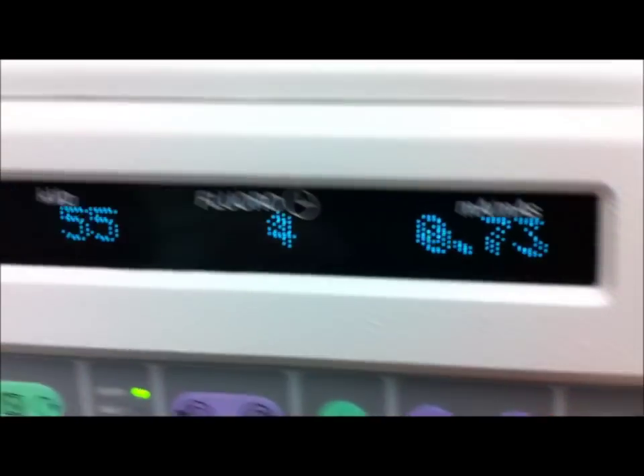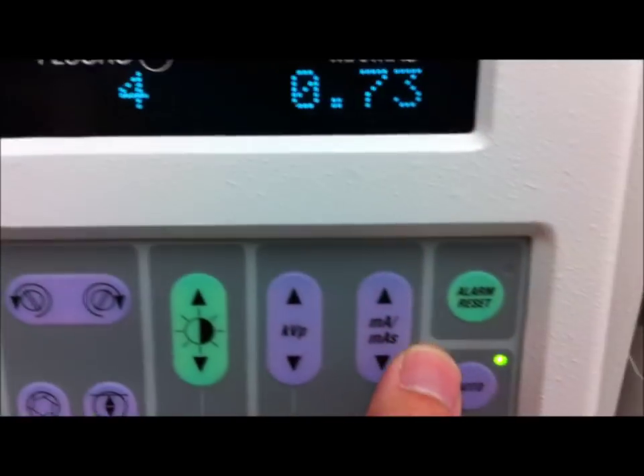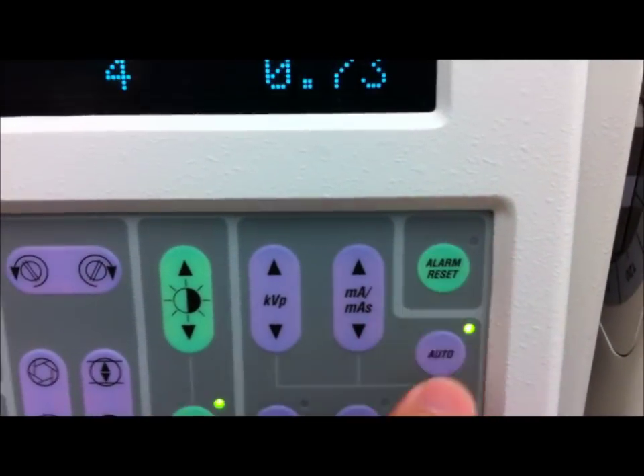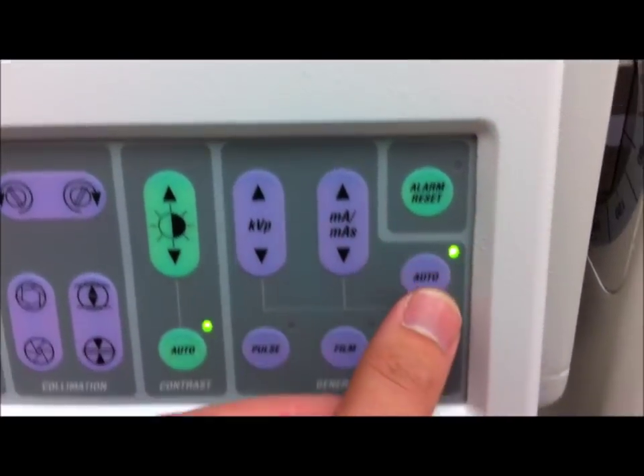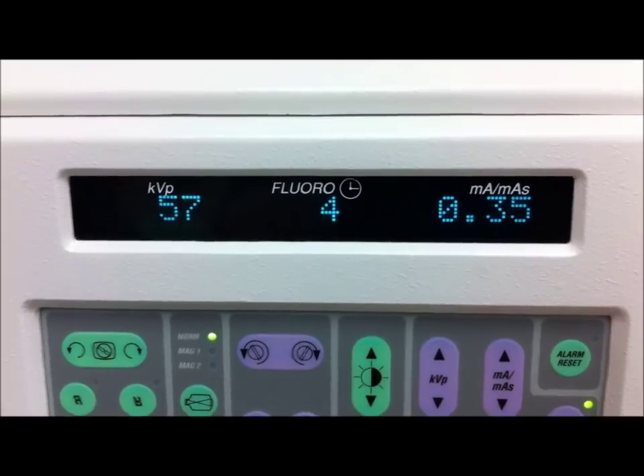Let's turn it back on. If you pass the five-minute mark on the fluoro time — which indicates the seconds and then becomes one minute and so on — you can press this to reset it; it'll light up and beep. This is low dose mode. What this will do is raise the KV and drop the MA.